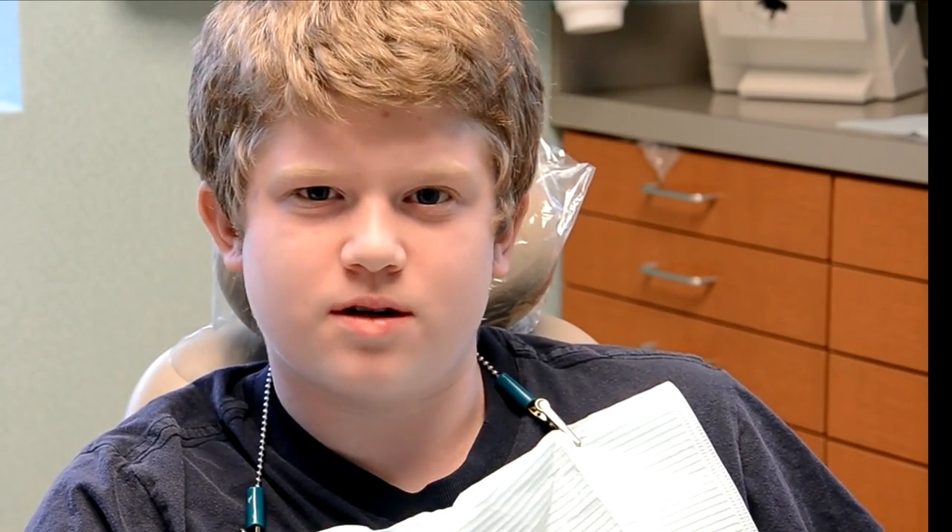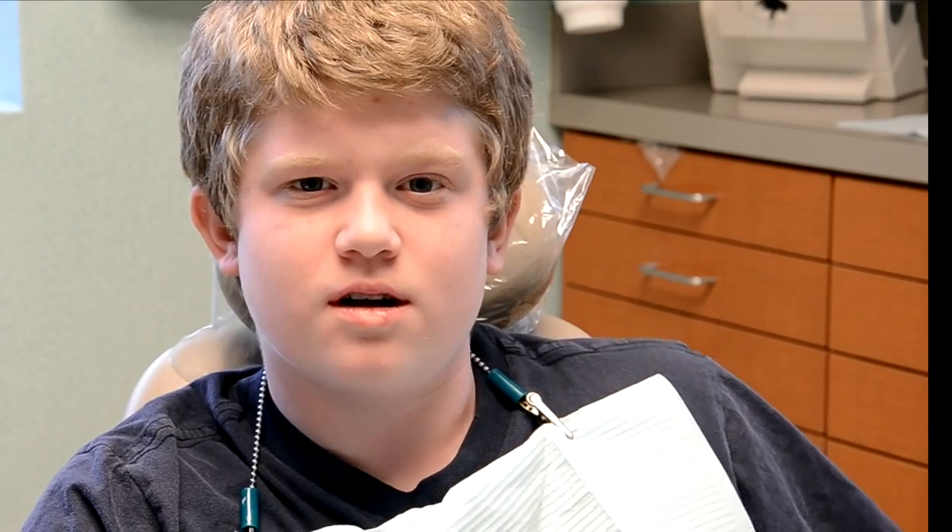Hi, my name is Jason, and I just got my braces off, and I had white spots because I didn't brush well. Now I'm getting the white spots removed without drilling and the shots.